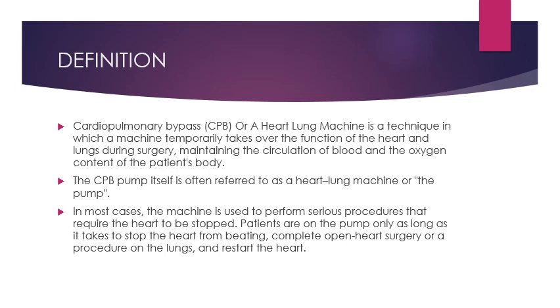Now, in most cases, the machine is used to perform procedures that require the heart to be stopped for some time. Patients are on the pump only as long as it takes to stop the heart from beating, complete open heart surgery or a procedure on the lungs, and then restart the heart again.